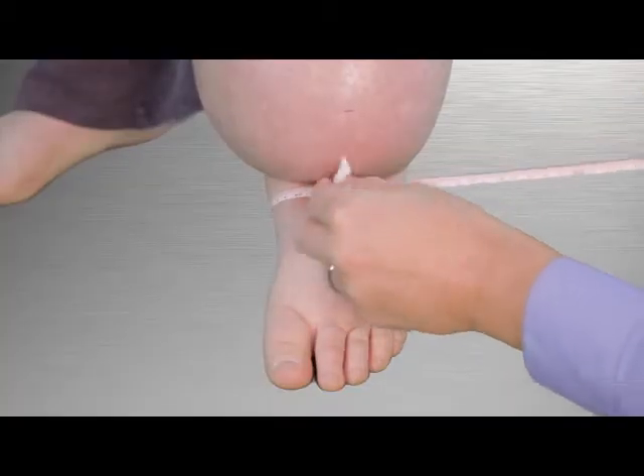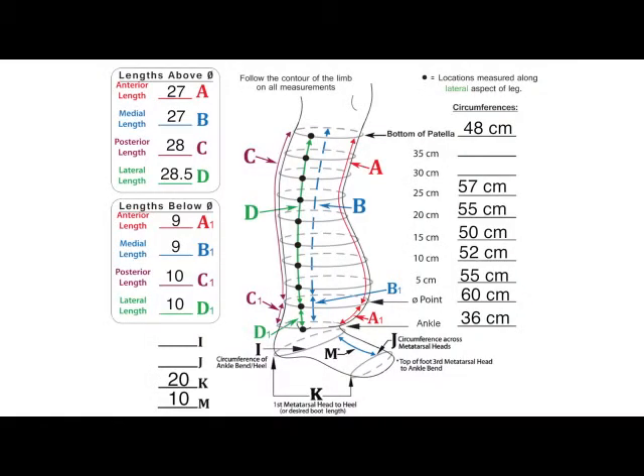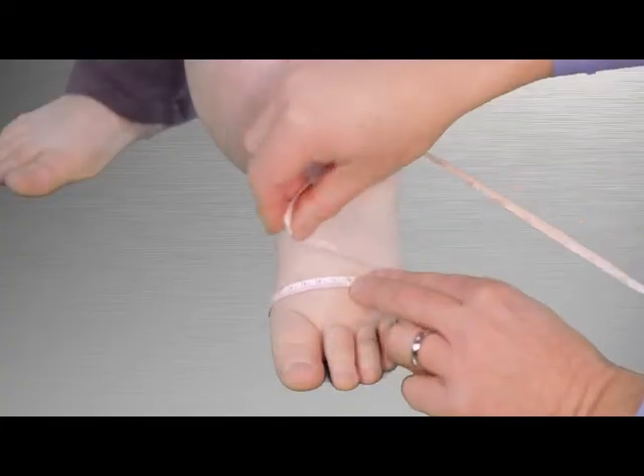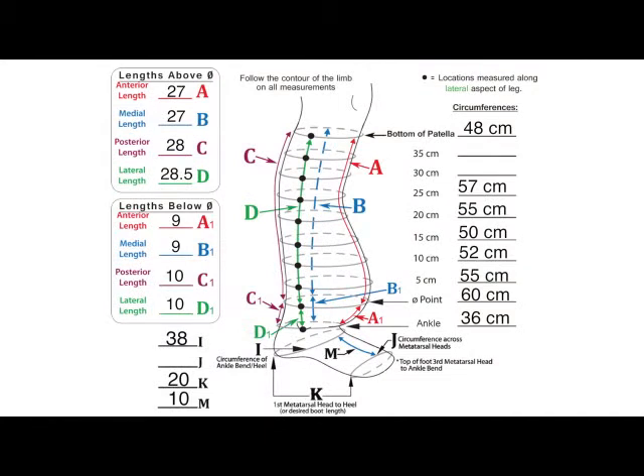Next, encircle the tape measure around the heel and the ankle bend and record the circumference on line I. Finally, measure the circumference around the metatarsal head and record the value on line J.